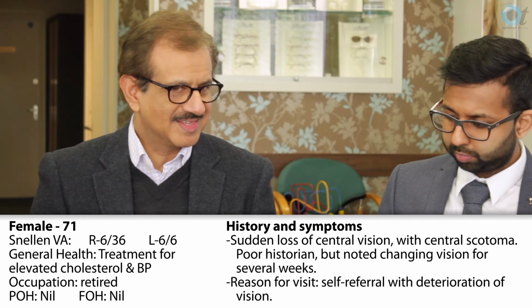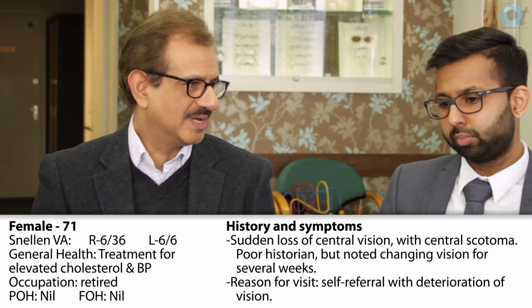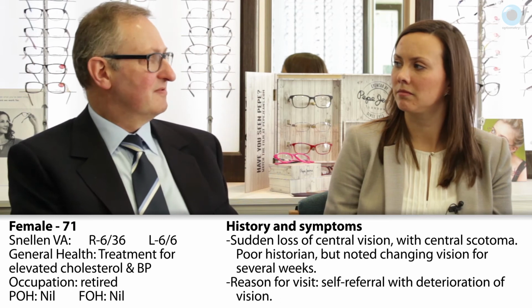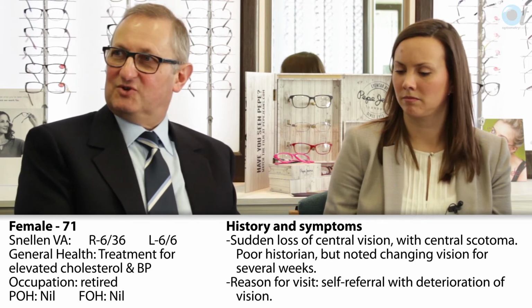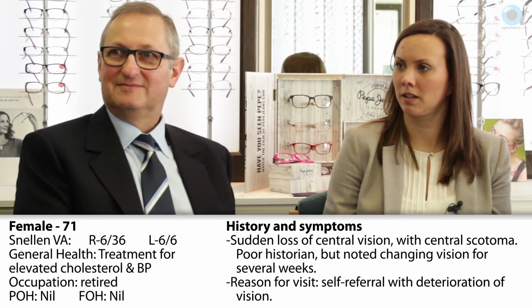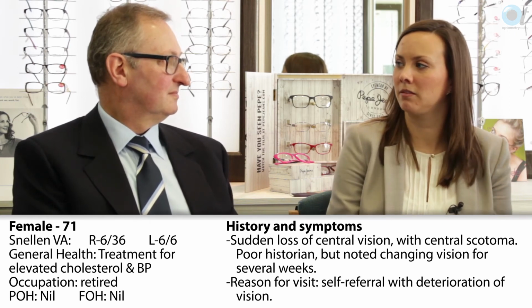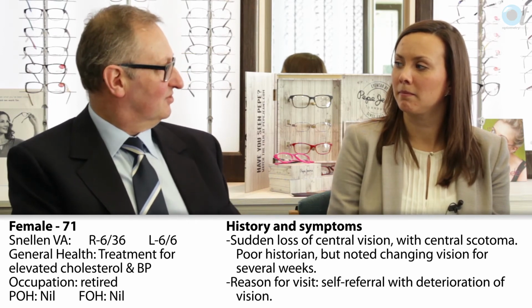So I think before making any decisions, before worrying the patient, adequate checks should be made, and then discussion carries on from there. Does anybody think there'd be a chance in that hypothetical case of the little bit of traction on the left eye that it will self-resolve? Could it? Yeah. It can do. If you get a nice clean break from the vitreous and the retina, then yeah, nothing may come of it. You might tap down and just be all right.